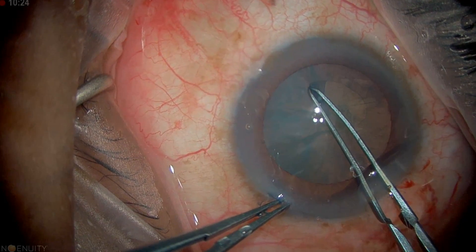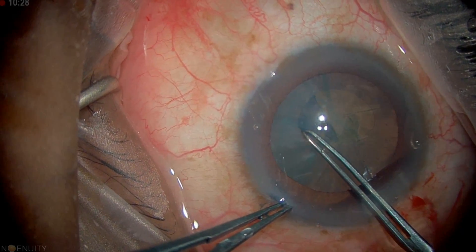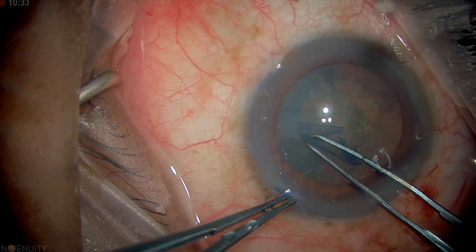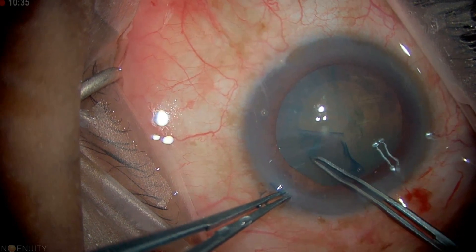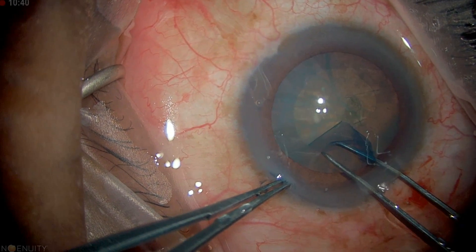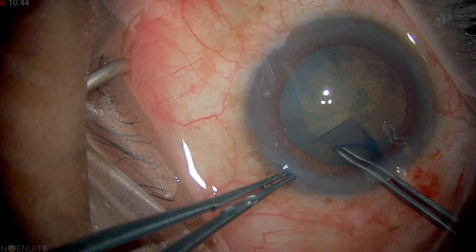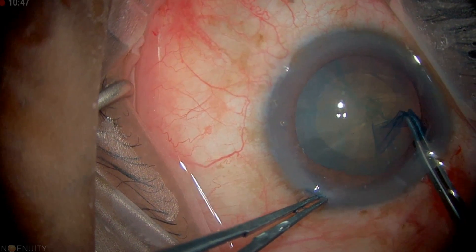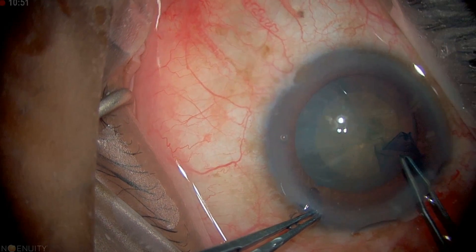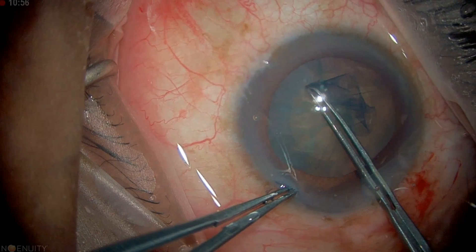The key thing with the flap is grabbing about one to two millimeters away, keeping that fold. That fold is a critical part — it's what gives you control. Keeping that fold all the way around, and sub-incisionally at about 11 o'clock you want to grab and take it all the way around to the other side. Often there's an opportunity to re-grab at that side as well and finish off your capsulorhexis.